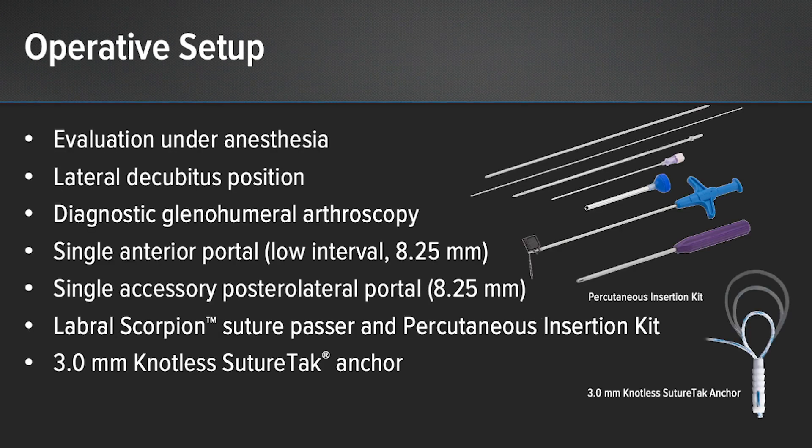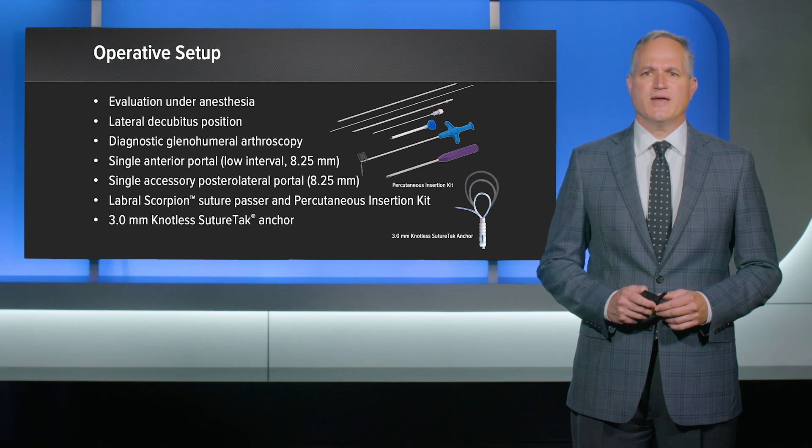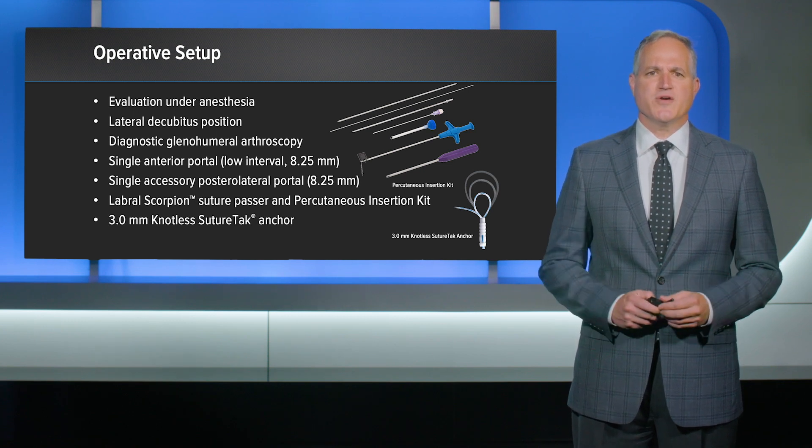My operative setup includes starting with an exam under anesthesia, patient placed into a lateral decubitus position, standard arthroscopic portal for viewing and performing a diagnostic arthroscopy, and a single anterior portal low in the rotator interval through which an 8.25 cannula can be inserted. I'll oftentimes use a single accessory posterolateral portal in addition to help with suture management if necessary.